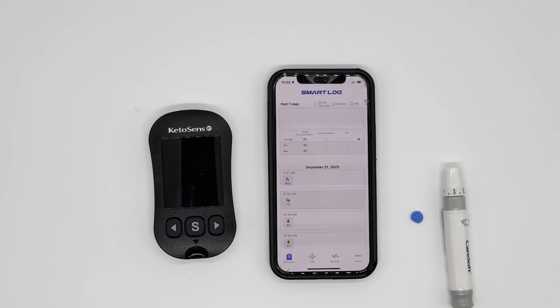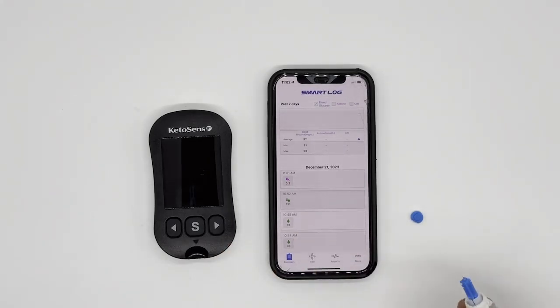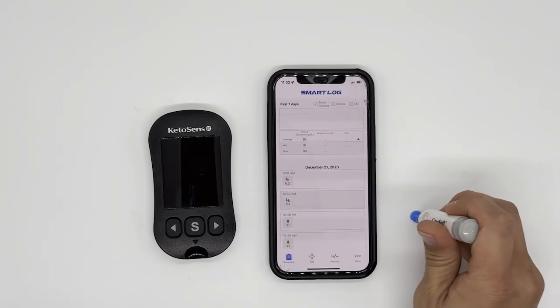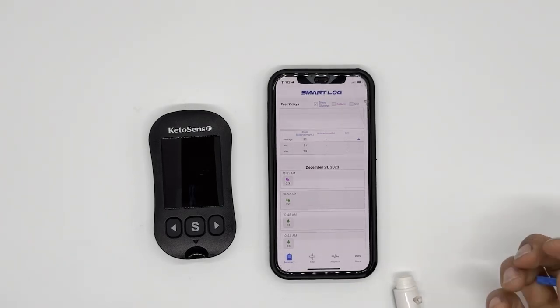That's how you pair KetoSense BT onto your mobile application. You can discard the lancet by taking out the cap and recapping the lancet needle with the lancet cap.